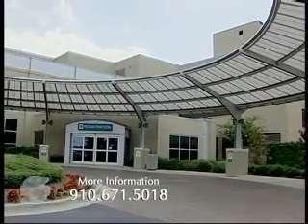During your stay here at Southeastern, there's probably not a visit that you've had here that you haven't had a specimen taken by the laboratory, and that would be by our phlebotomists, who are trained people to specifically collect blood and to handle the blood appropriately, make sure it gets in the appropriate tubes for the various tests that your physician has ordered. Once that specimen has been collected, the phlebotomist will either transport that specimen to the laboratory themselves or use the pneumatic tube system and continue on their morning rounds.